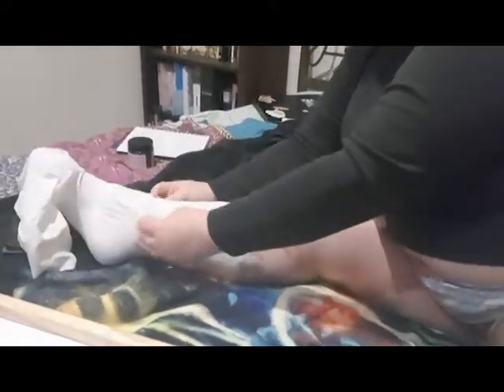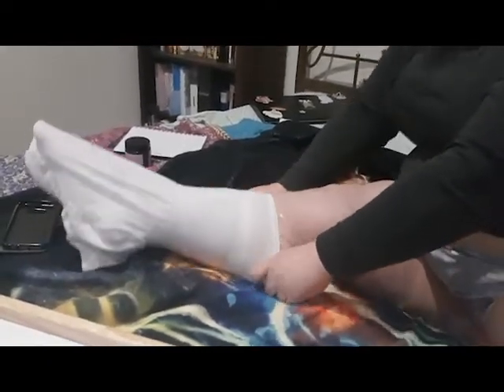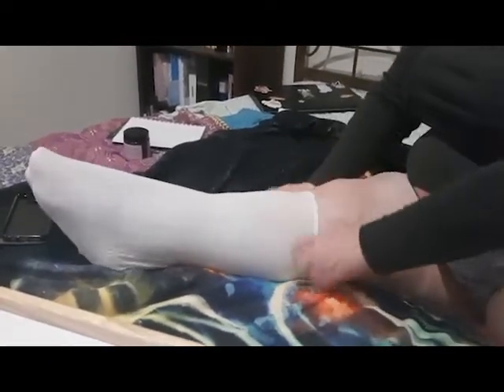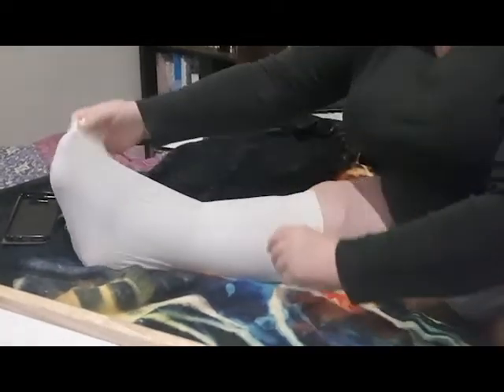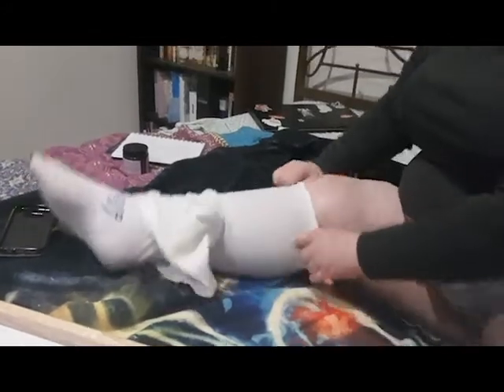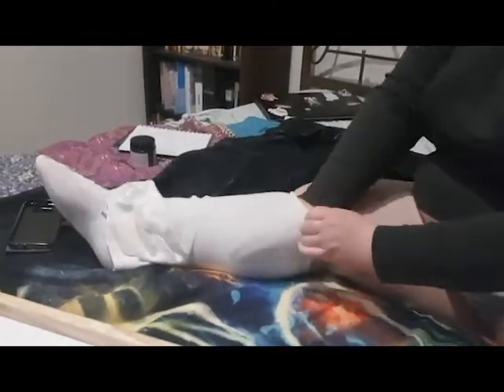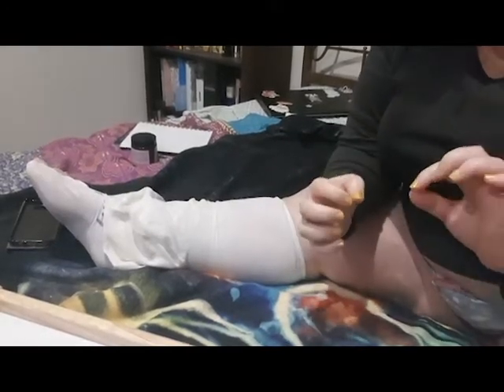Then you grab the next bit, slide it up. You can see again, it's doubled up there. Slide it up, pull it over. Do it slowly, slowly. You really don't want to be rushing this. And you can see that it has twisted. That little bit is now underneath. So it's really important: don't try to do this with long, sharp nails.